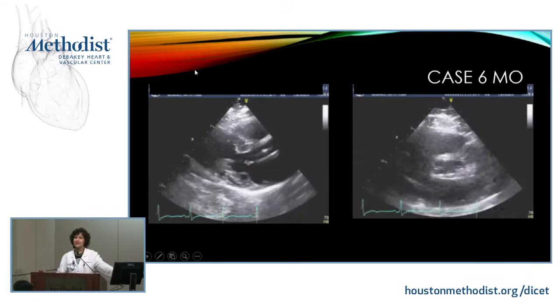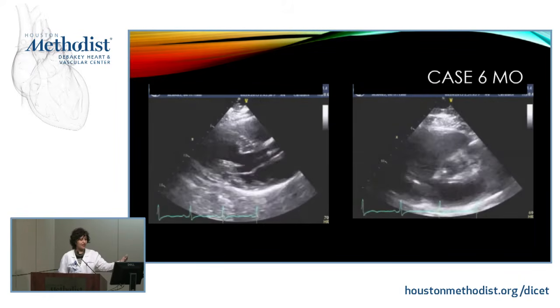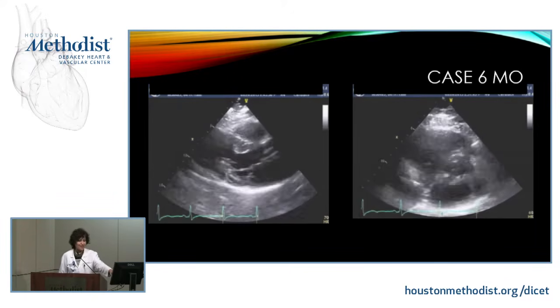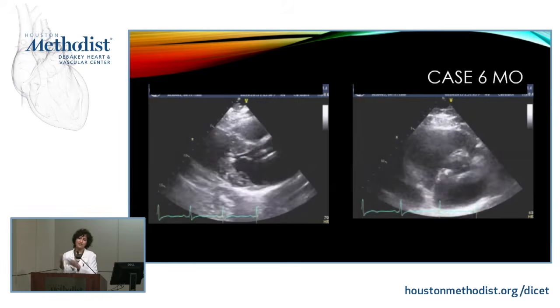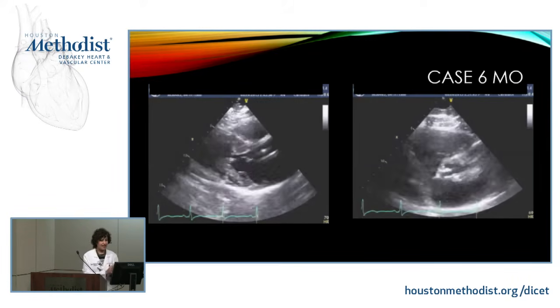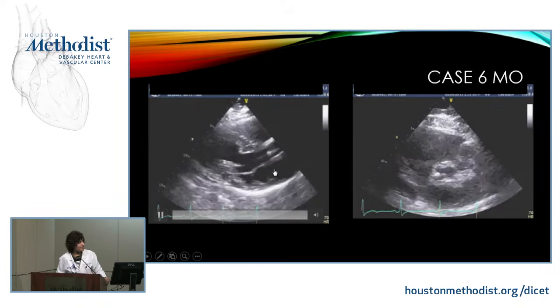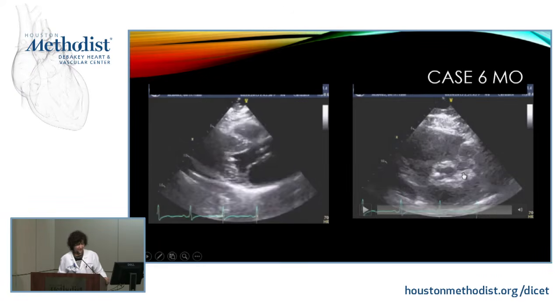This is a real patient who came in. I want you to see this echo. No fake patients. But this was a very classic case in how the studies evolve, how the physiology evolves. So the patient had, you can see, a little calcification here of the aortic valve. You see LV great function, no abnormal septal motion. The aortic valve looks calcific.